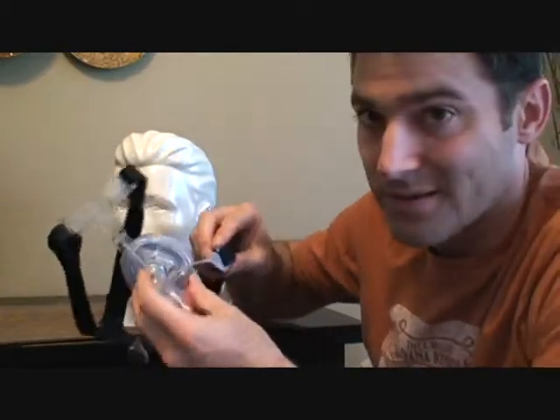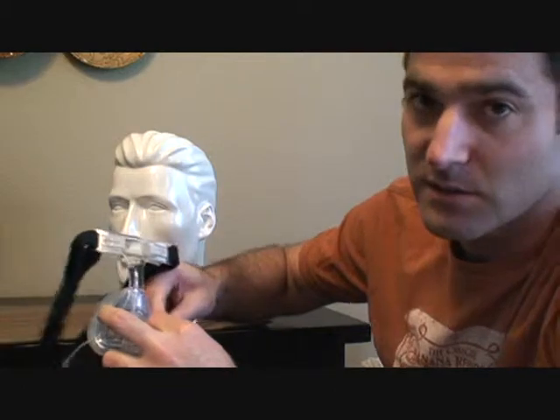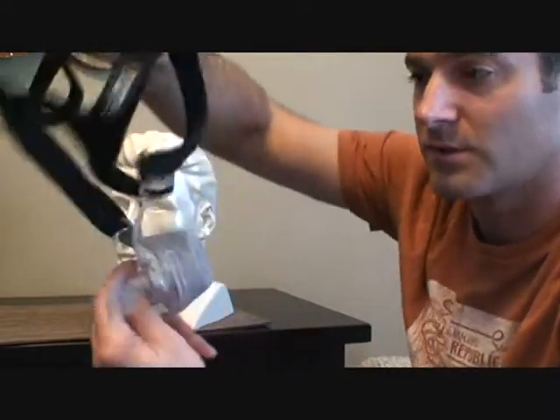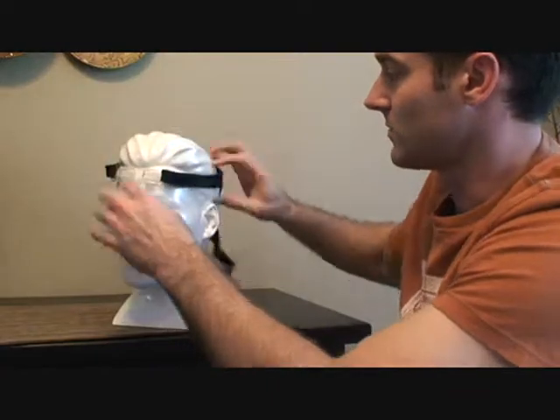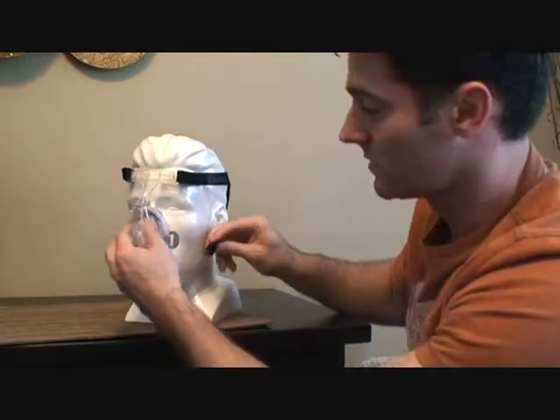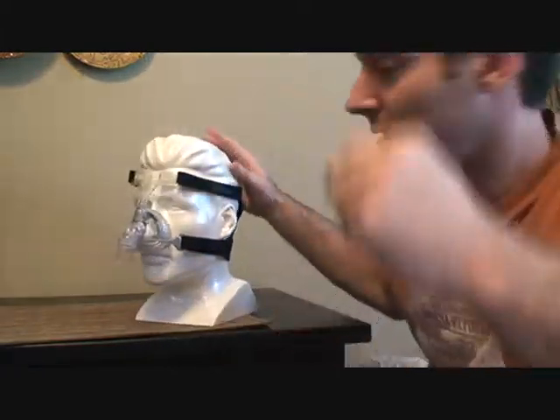One of the bad things about this mask is you can only clip it through or slide it through these clips. There's no real quick release clip on this mask like other masks have. So just undo one side, turn this inside out, hold it to the nose, and pull this over. So this makes a nice halo around the head. Make sure all the straps are straight and not twisted. Then you want to hook this back here. And that's it.